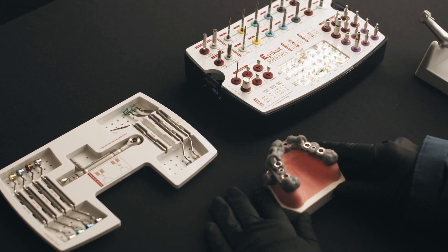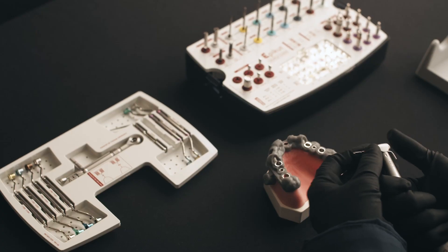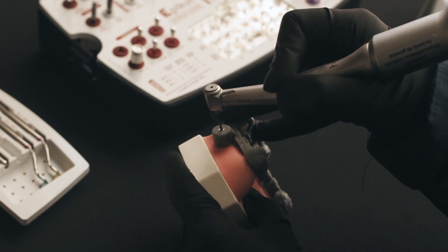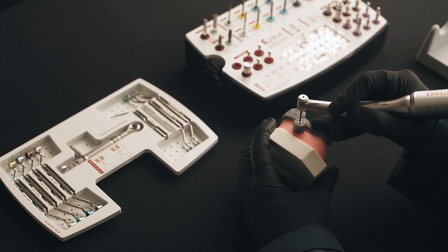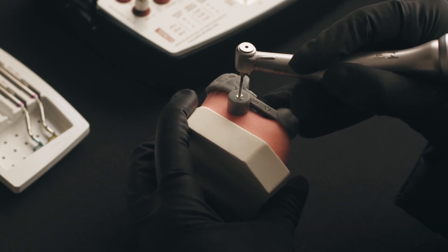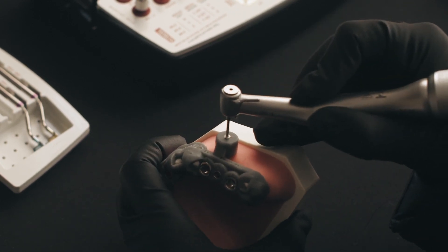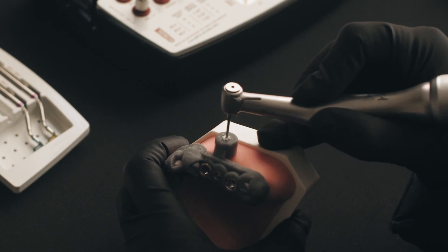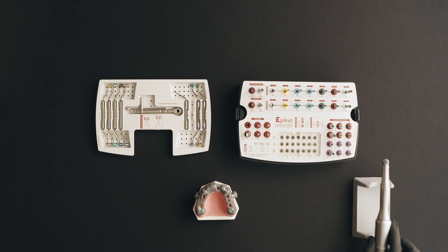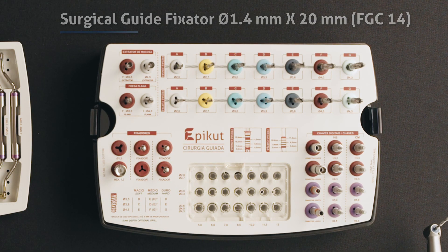Let's start by securing the guide using the 1.3 millimeters drill. Place your tool inside the lateral sleeve and start drilling. After drilling with a 1.3 millimeters drill, select the fixation pin from the guide and place it manually.